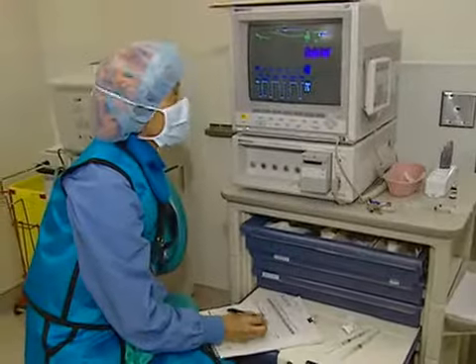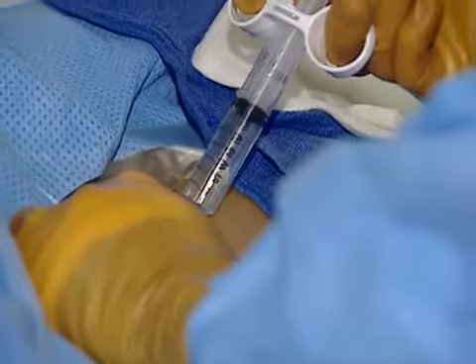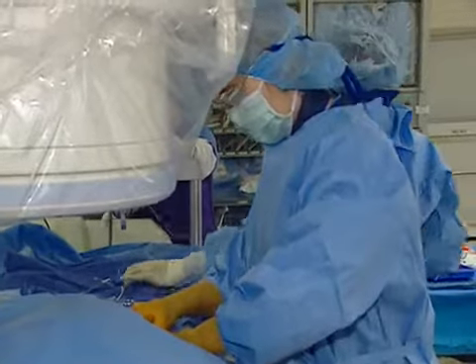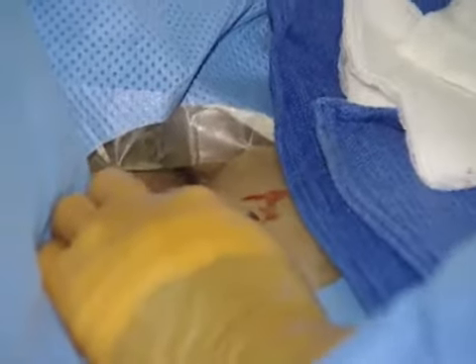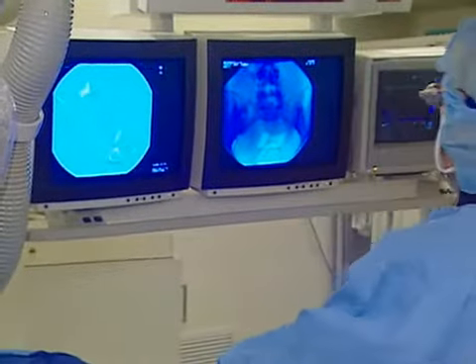Prior to undergoing a UFE, patients are put under conscious sedation as well as given a local anesthetic to the pelvic region. A small nick, approximately 2 to 3 millimeters in diameter, is then made in the patient's groin. The interventional radiologist then guides a very thin catheter and guide wire into the incision, through the femoral artery, and up into the main uterine artery.